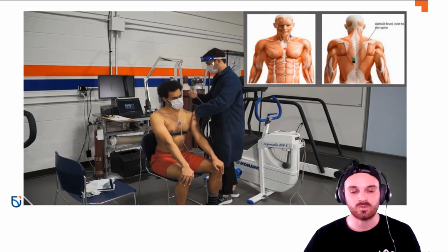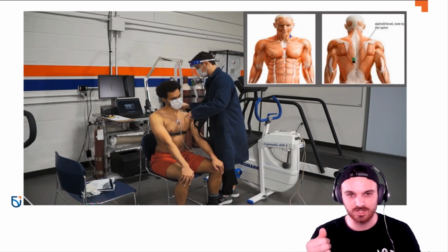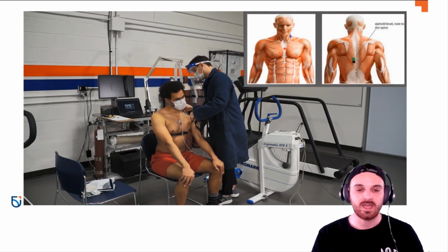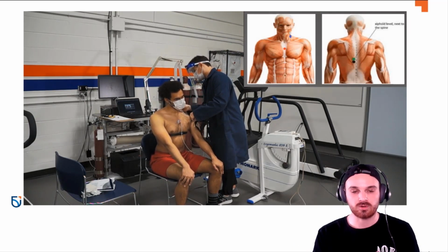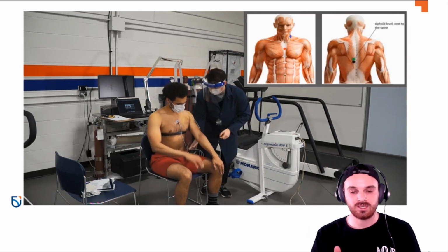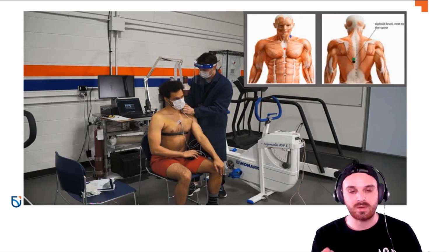If that's the case where you are pressing it on, it's just pushing into their skin and they don't love it, you can take the lead off, put the electrode on, and then stick the whole thing back on them.